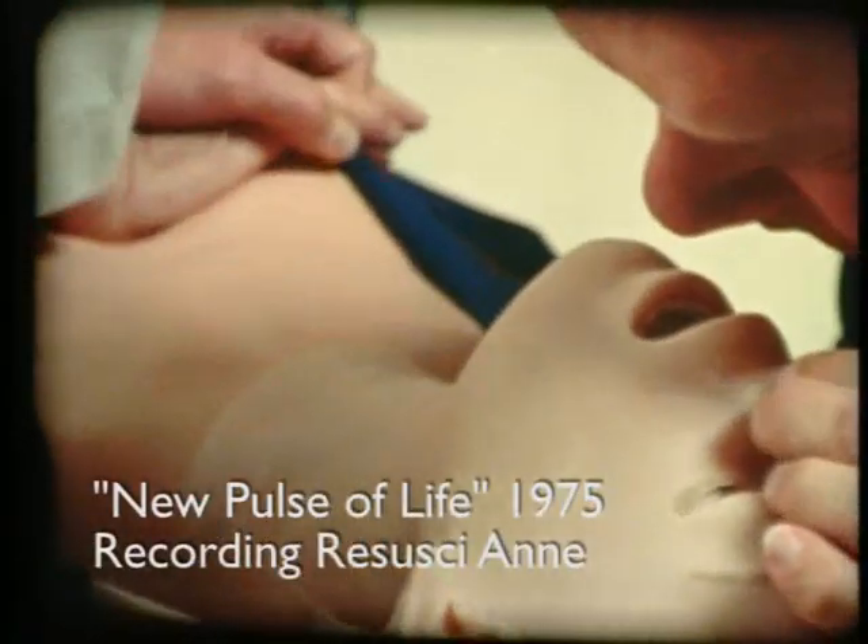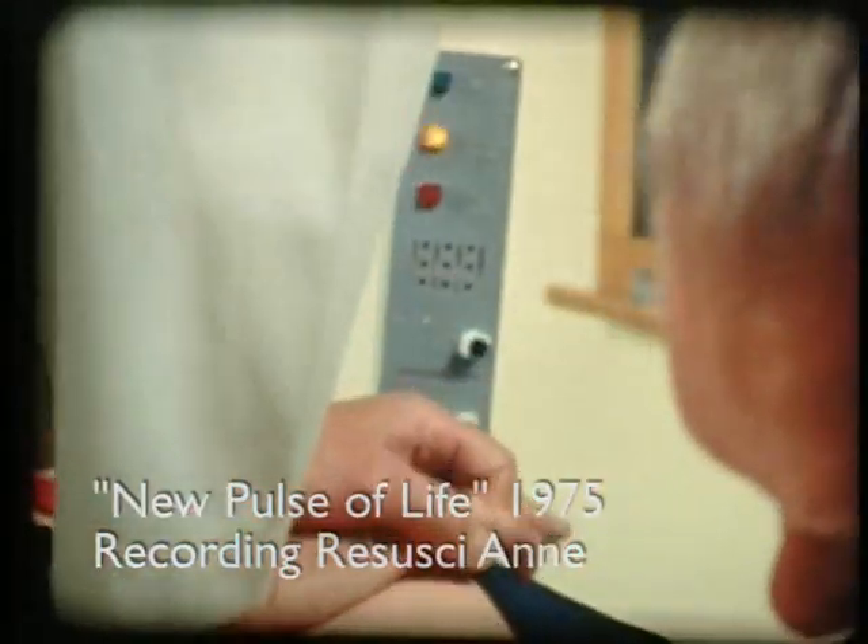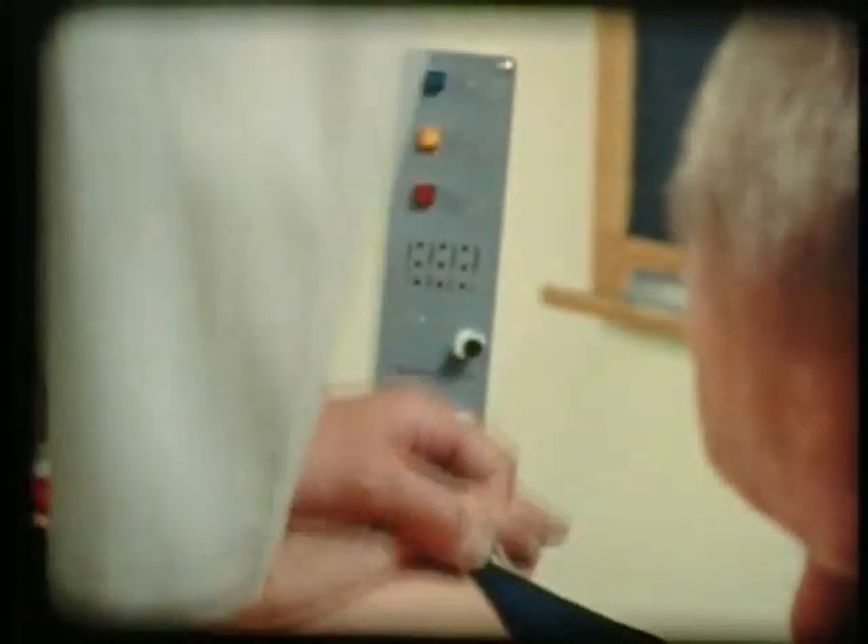The sequence of steps is demonstrated here on an automated mannequin with colored lights to indicate adequacy of compression, adequacy of ventilation, and mistakes in hand position. A strip chart recorder provides a permanent record with exact details of performance.